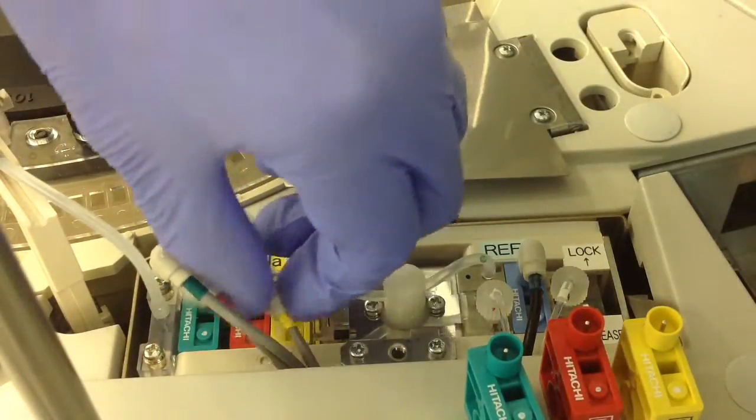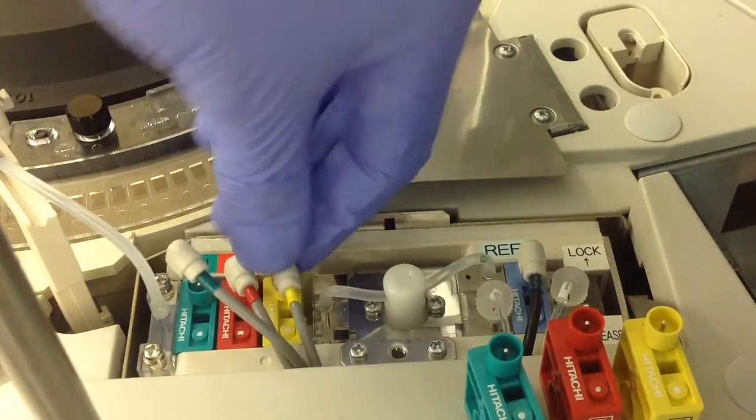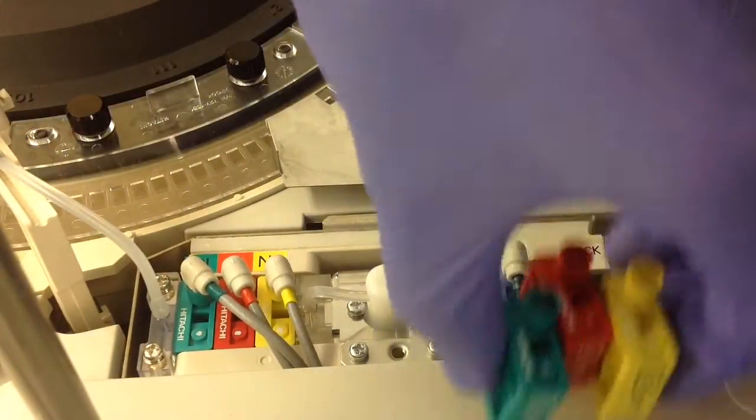Once you've slid the cartridges in, go ahead and re-plug the cables into the top of the measuring cartridges. You don't have to force it — just make sure it's nice and firmly in place. Then go ahead and switch from release back to lock and you're all done.